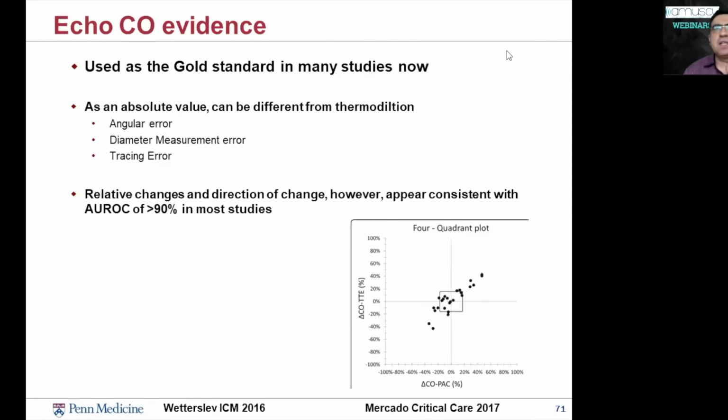Okay, well, Cameron, regarding the B lines in cardiogenic shock, do you think that in patients with cardiogenic shock, we always will see B lines in this kind of patients? Is it mandatory to see B lines in patients with cardiogenic shock? If we see, for instance, if we have a patient with hypotension and hypoperfusion, and the cardiac output is low and the ejection fraction is low, and we see a very decreased mobility, etc.